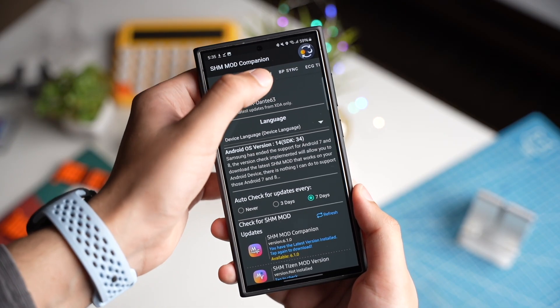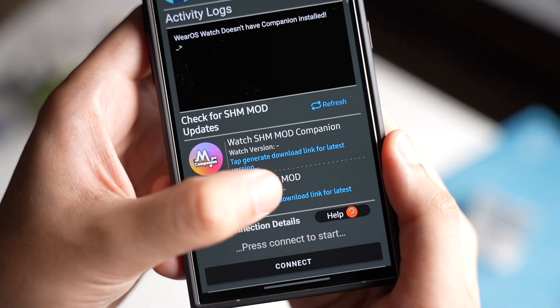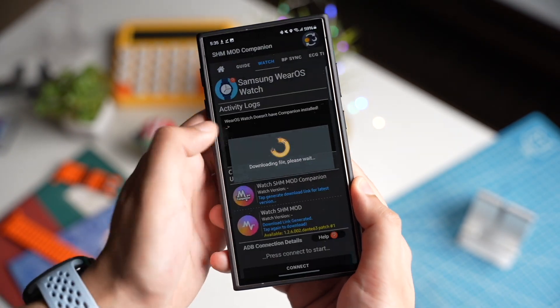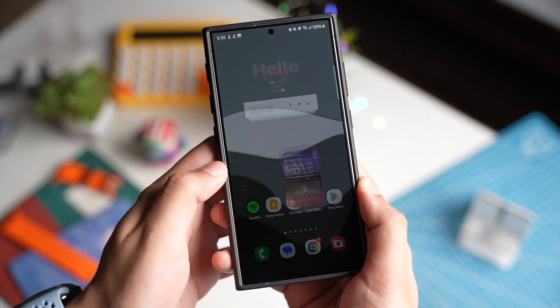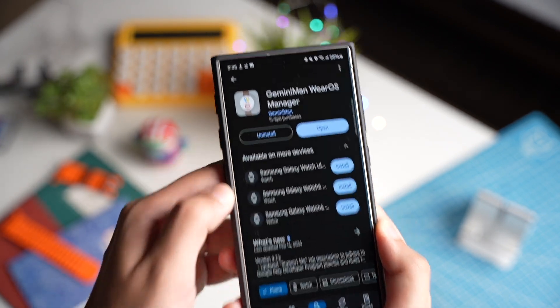After that, tap on Watch right here and download this second app that has to be installed on your Galaxy Watch Ultra or Watch 7. Now we also have to install an app from the Google Play Store — that is Gemini Man for Wear OS. Install this app on your Galaxy phone.